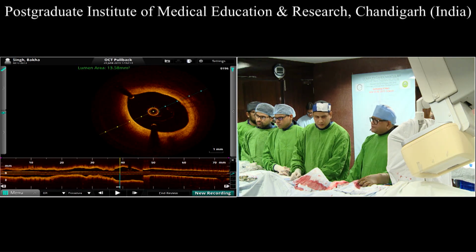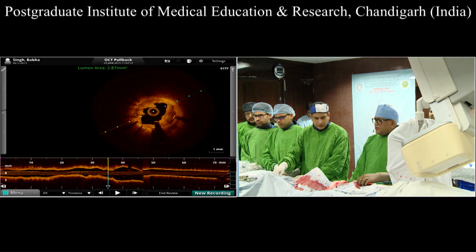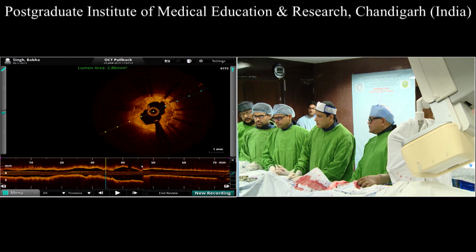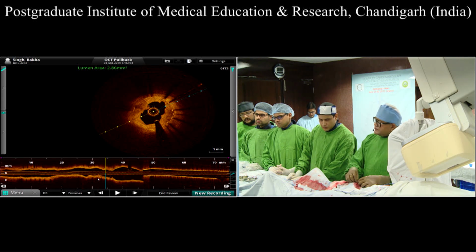Yeah. Okay, Dr. Reyes, following your OCT pullback, any comment about what type of in-stent restenosis it is? Distally, of course, it's homogeneous, but proximally there is atherosclerosis, there is a lipid core as well, so it's a fibrolipidic in-stent restenosis, which seems to be a characteristic of early in-stent restenosis of a drug-eluting stent. Any comment about the type of in-stent restenosis on the OCT with the duration of in-stent restenosis in, say, a drug-eluting stent or bare metal stent? Any comment from the chair?